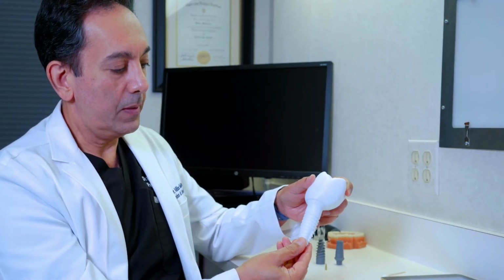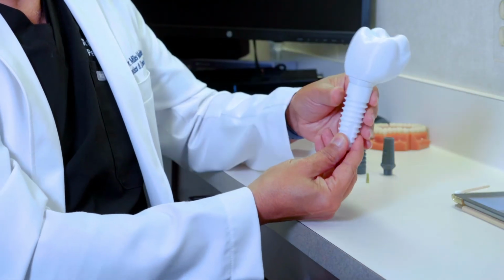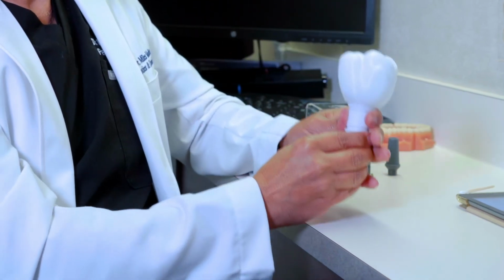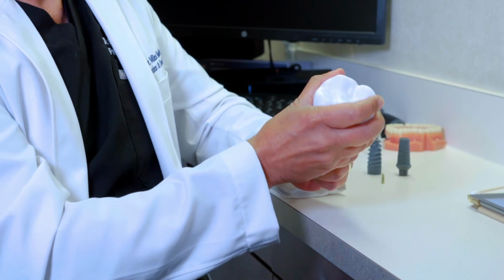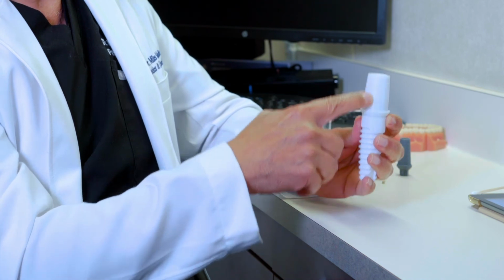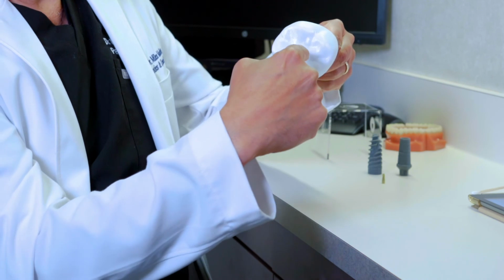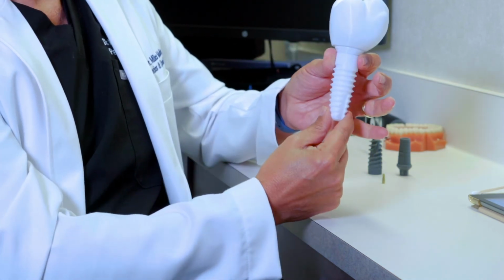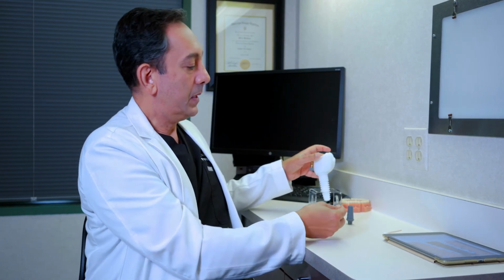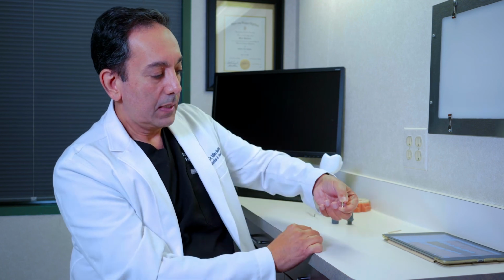This is a model of a dental implant. As you can see, it has threads, and that's what engages the bone and gives the implant its initial stability. And then once it's stable, then a crown is made that gets connected to the implant either through the use of something called an abutment, or most often it has a screw that goes right through this that connects it to the implant. So an actual implant is typically this size, so it's not super big as those models are.